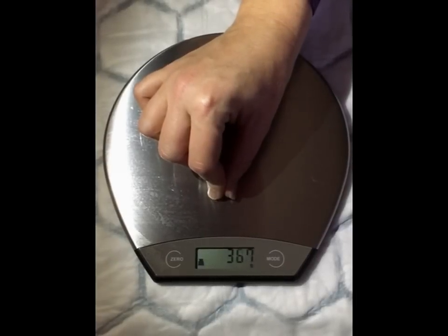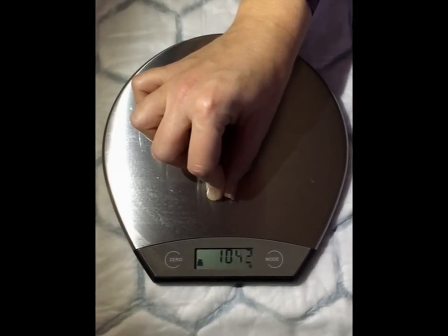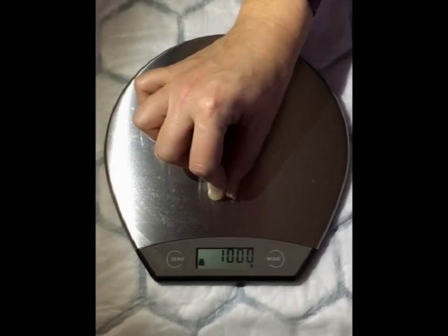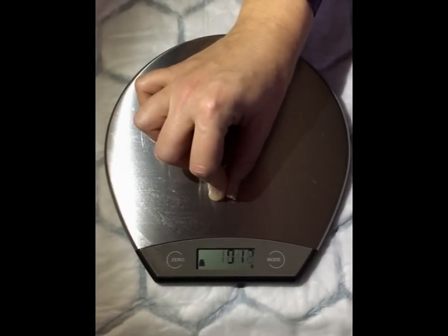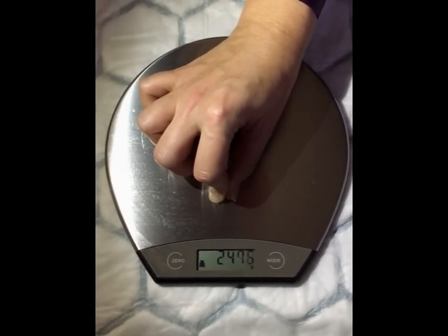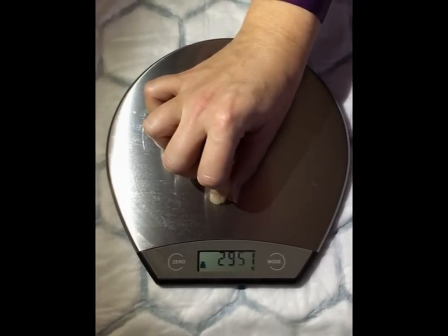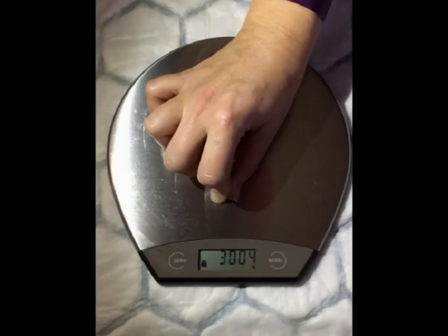As part of training, to ensure that the appropriate pressure is obtained, weighing scales can be used, with 1 kilogram force applied to the scales equaling 10 newtons, and 3 kilogram force equaling 30 newtons. This amount of pressure needs to be maintained throughout the intubation process until the endotracheal tube position is confirmed by the anaesthetist and they instruct their assistant to remove it.